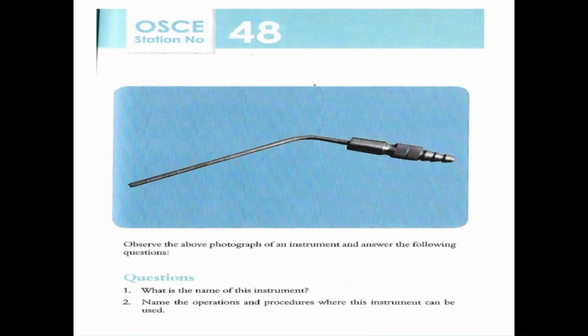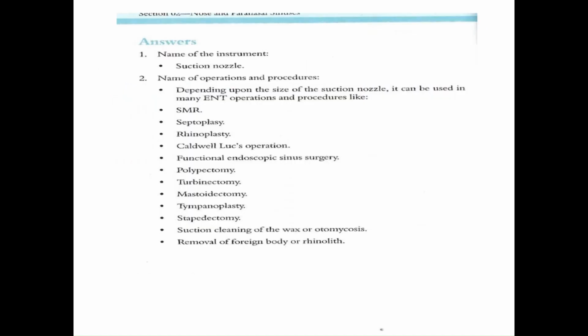Observe the above photograph of an instrument and answer the questions. Name the given instrument and its use. Name the operation in which this instrument is used. It is a suction nozzle. Used in septoplasty, rhinoplasty, Caldwell-Luc operation, FESS, polypectomy, turbinectomy, mastoidectomy, tympanoplasty, and suction cleaning.